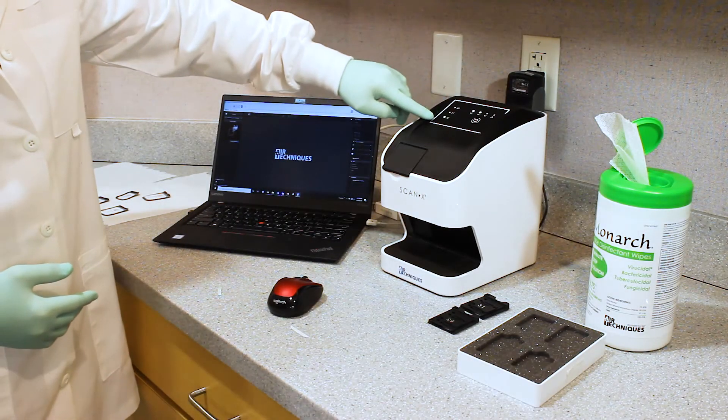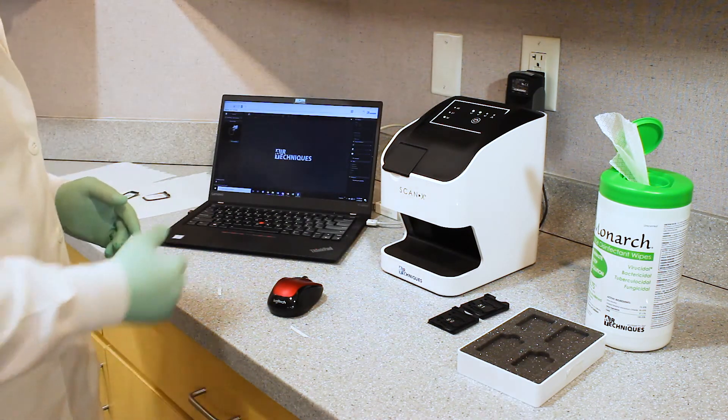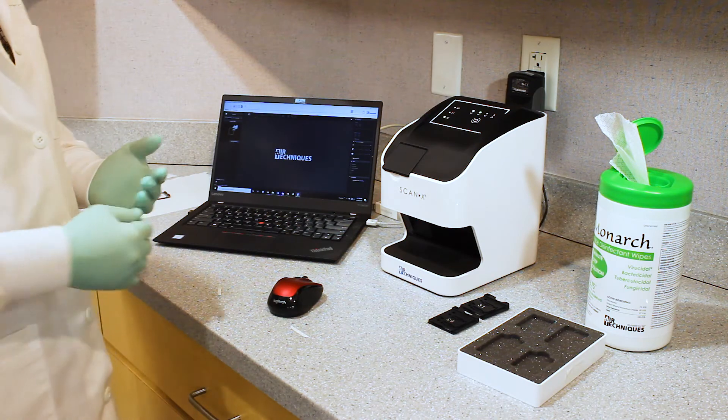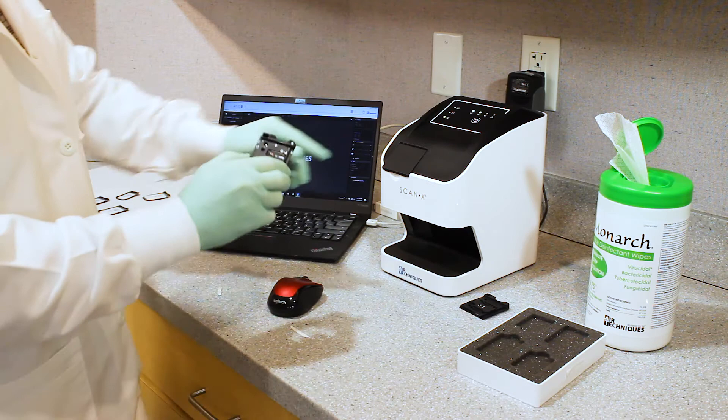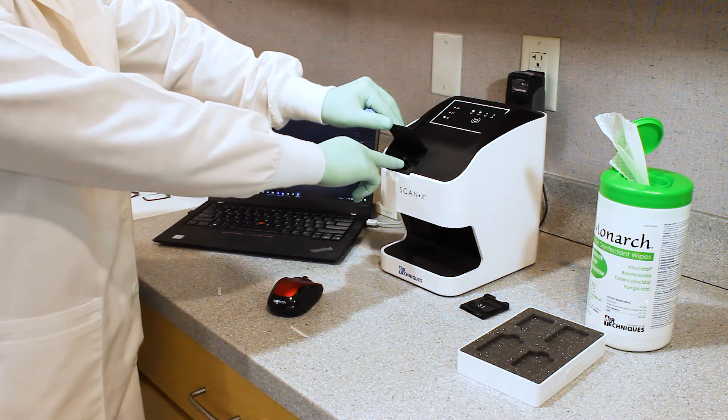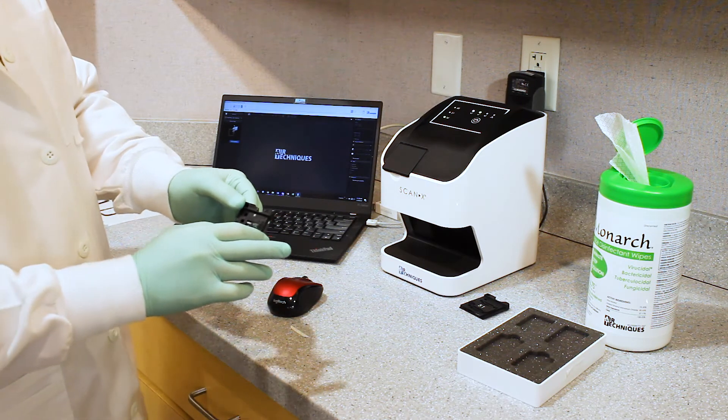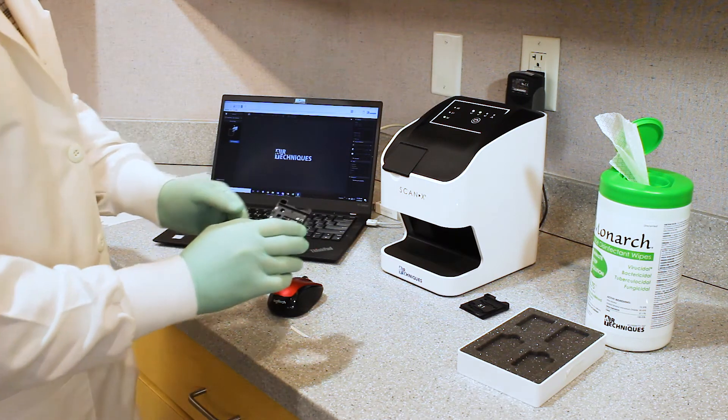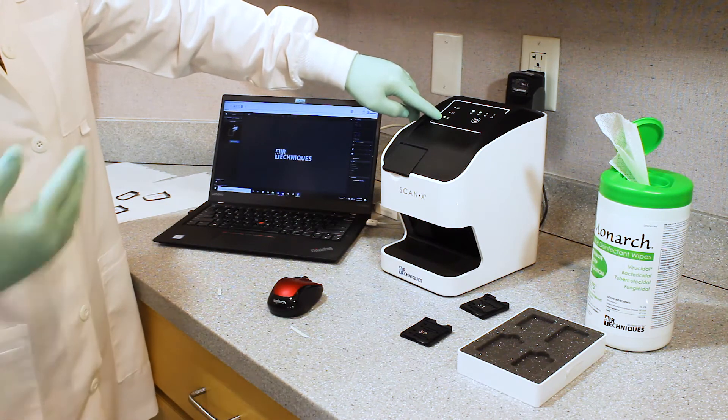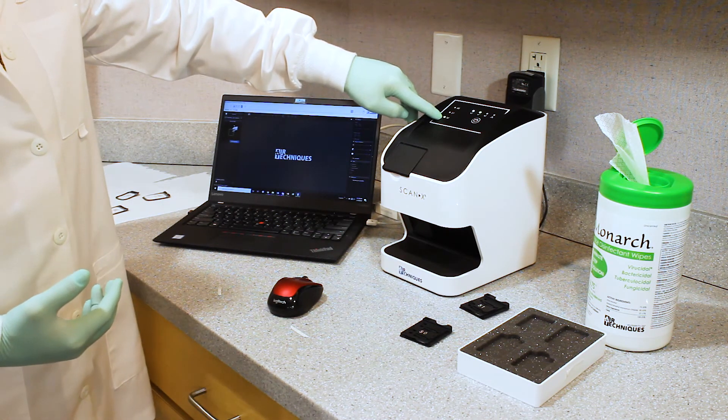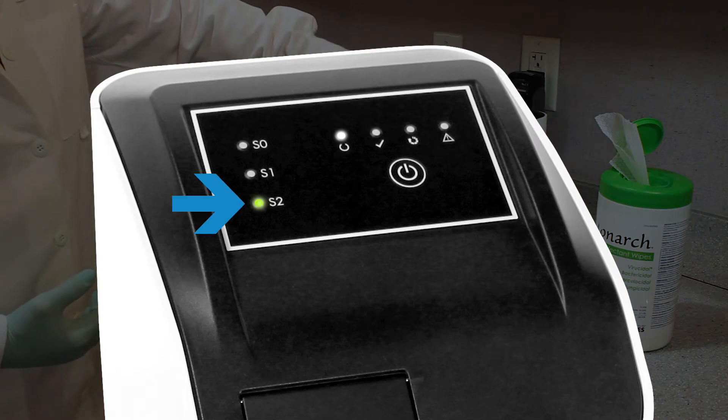Now, what you're seeing over here are which cartridges happen to be in the ScanX. So because this machine can do size zero, size one, and size two, they have specific cartridges that would be inserted into the machine itself, depending on what plate we are scanning at the time. So right now, the size number two is inserted into the ScanX, and that's the first plate that we're going to scan into the machine. So that's why that is illuminated with S2.